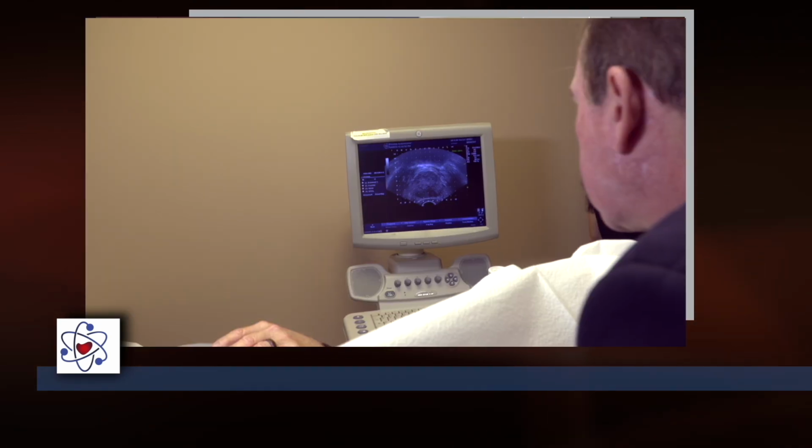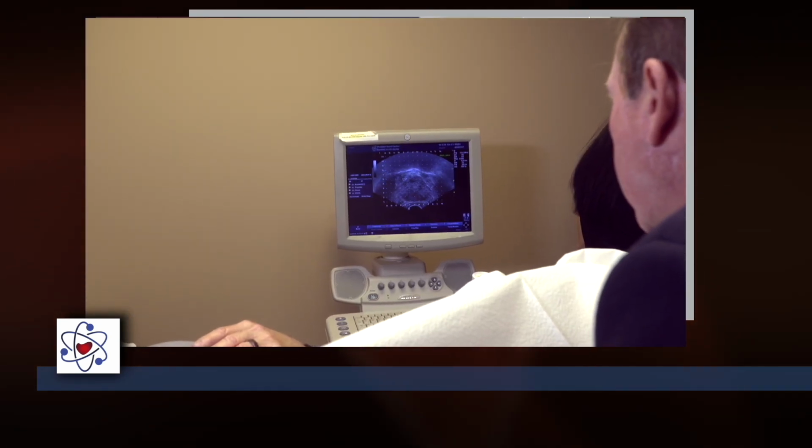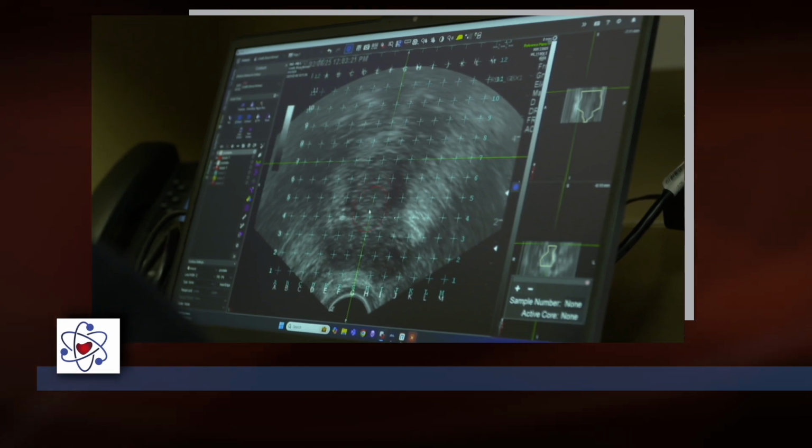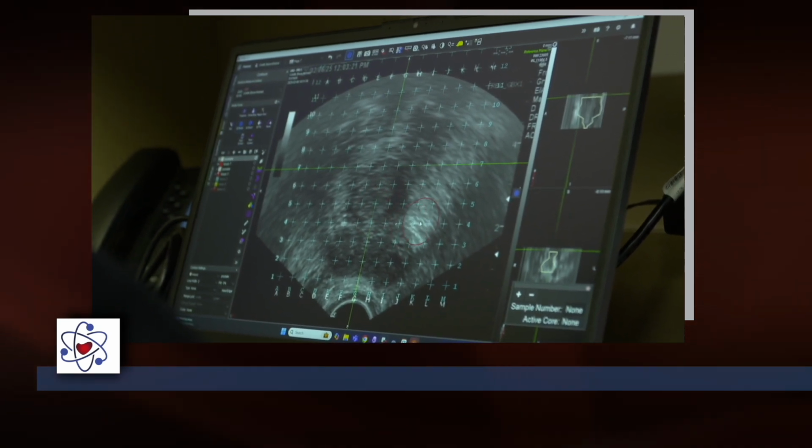Another thing that typical urologists don't do is pre-plan a biopsy. Pre-planning is very important. It allows me to do a virtual biopsy on you in the office. And it's usually done a week or two before the procedure. We put you on your back in one of our exam rooms in stirrups. We put an ultrasound transducer in your rectum. We take a few pictures of your prostate, and we upload them into my treatment planning system. And then that treatment planning system will also have your MRI scan within it already, and I'll merge those images.